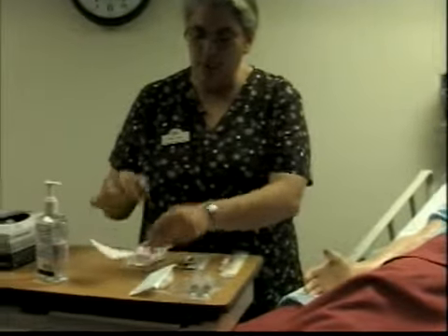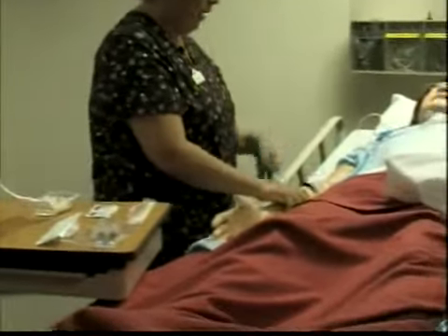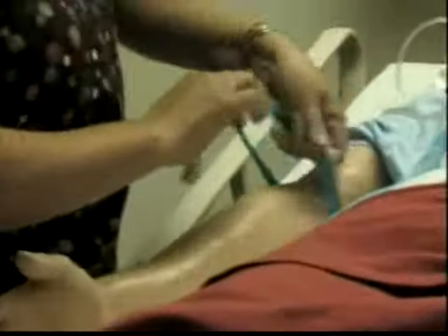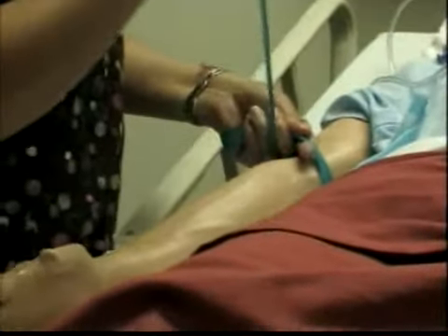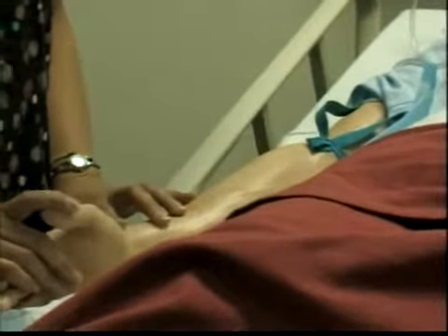So now I'm going to remove my tourniquet because I'm going to decide which vein I'm going to use. You use your tourniquet and you apply it about 4 or 5 inches above the site that you think you're going to puncture. You perform a loop, not too tight, because I've seen people pull on this really tight, which will actually hurt the client. You want to make sure that it's snug, so that you have some type of pressure to allow the vein to fill.